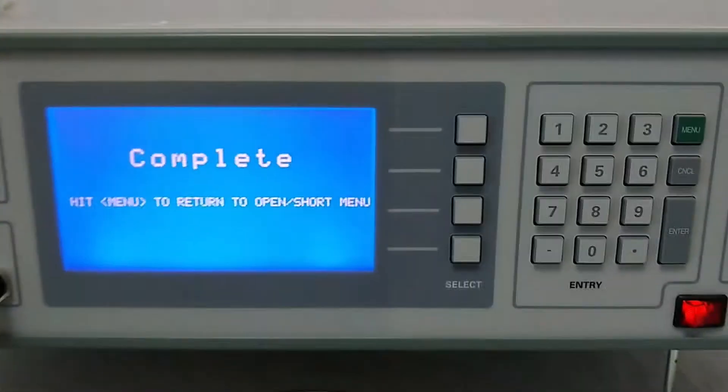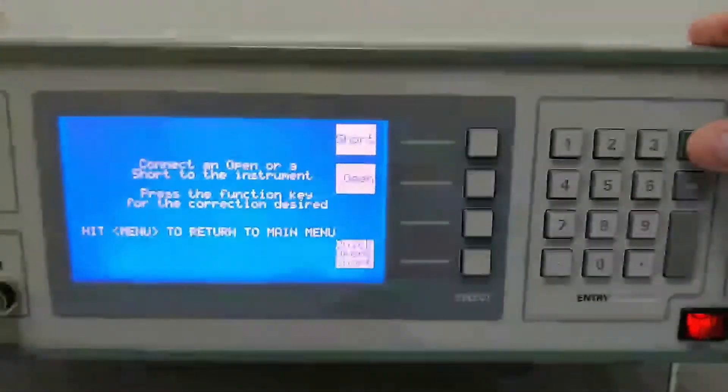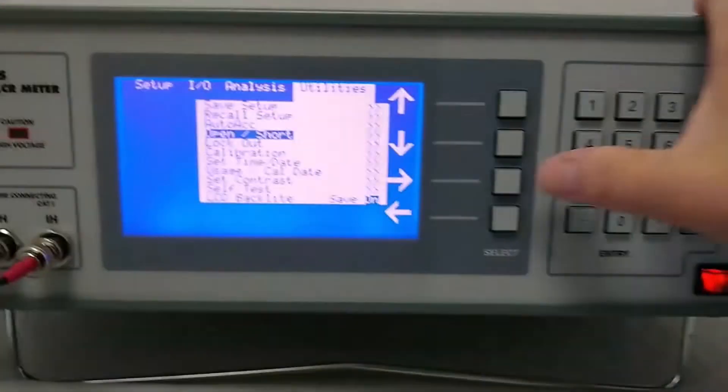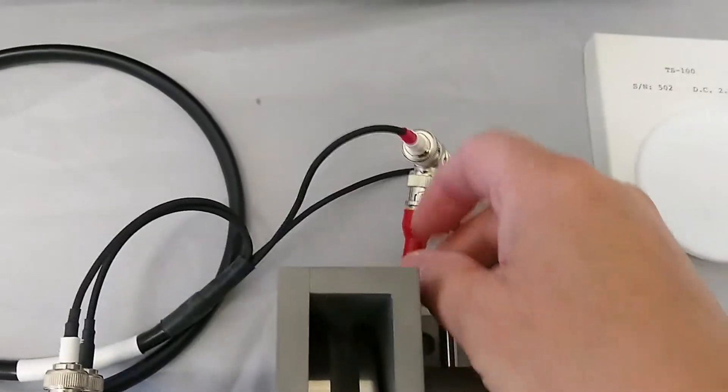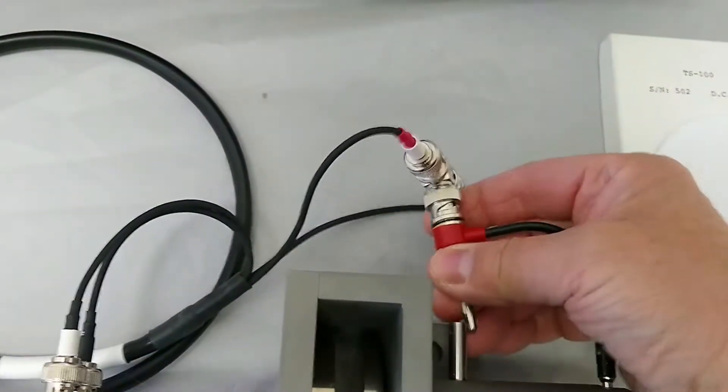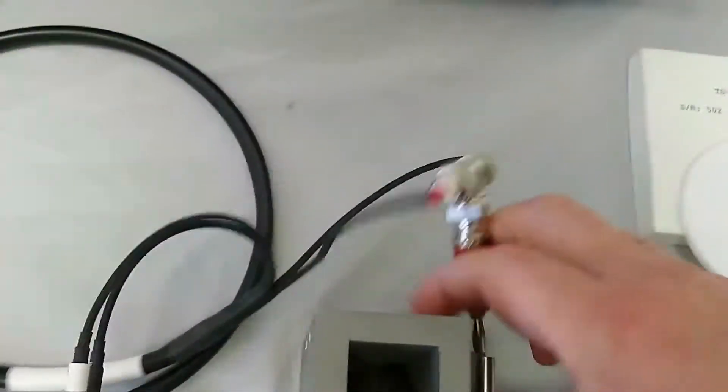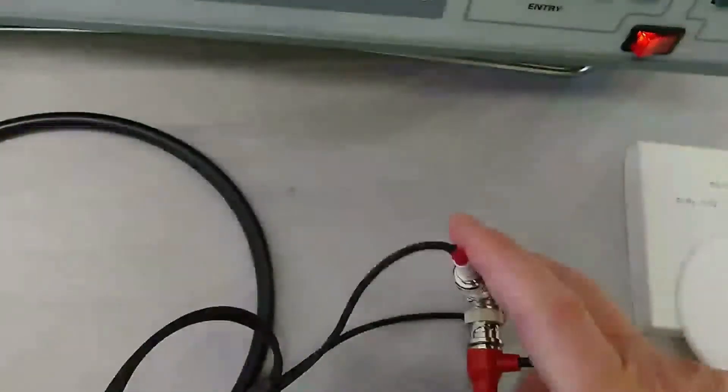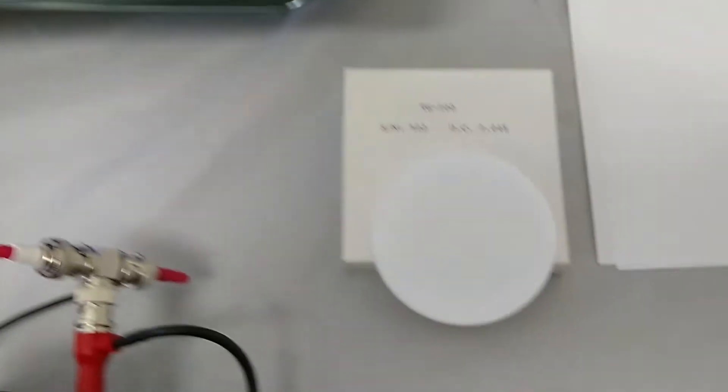At this point, the open has completed. We can press the menu key and the menu key once more to get back. At this point, we're back to the measurement menu. We can then reconnect the cell by reconnecting the banana so that it's connected into the cell.